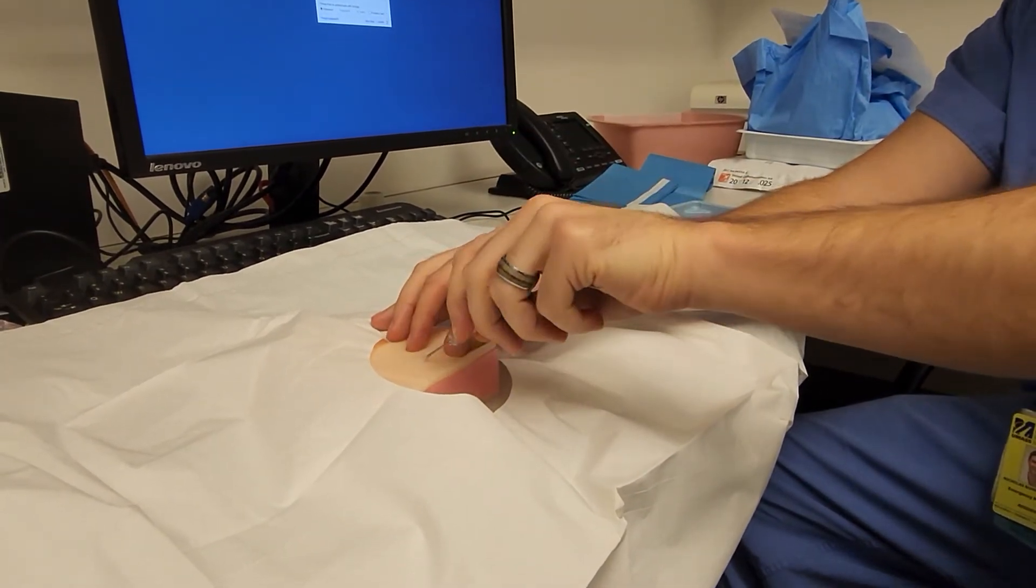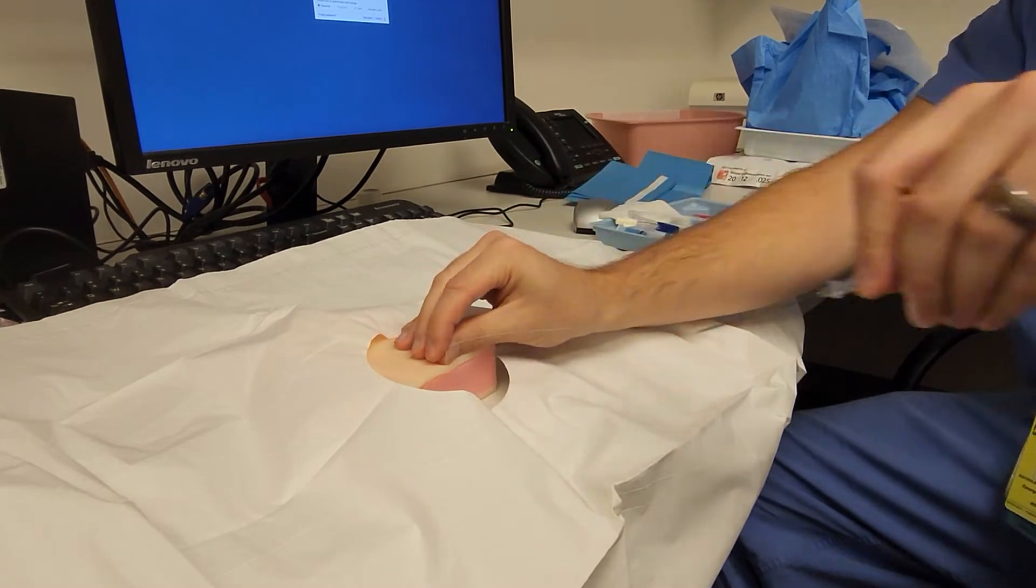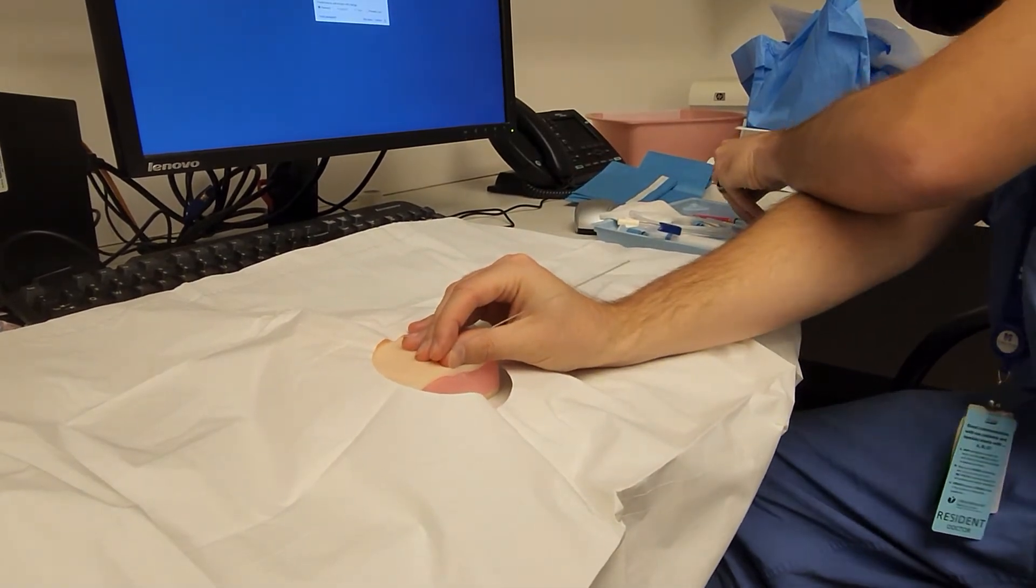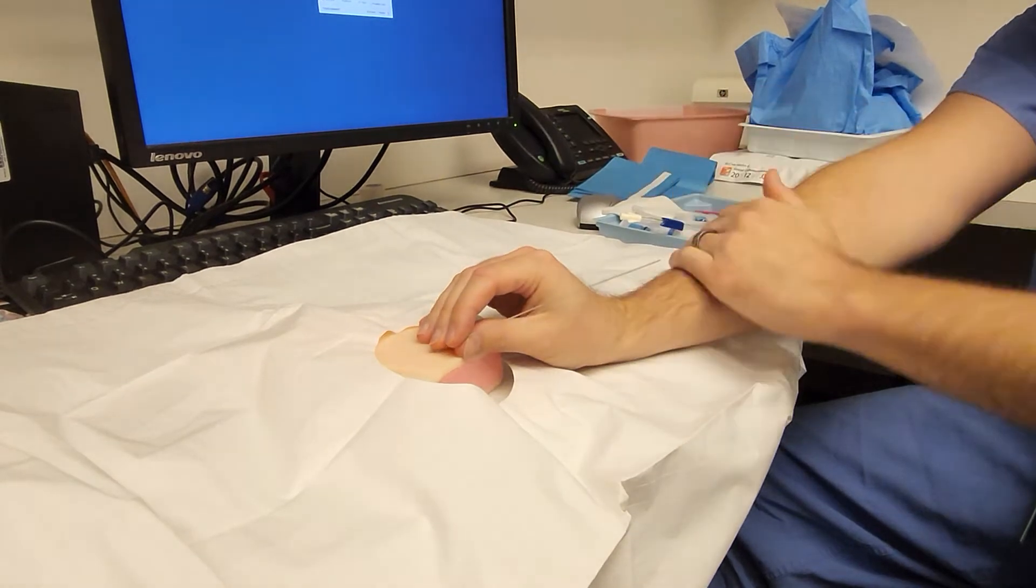Remove your needle. Confirm placement of the wire with the ultrasound.